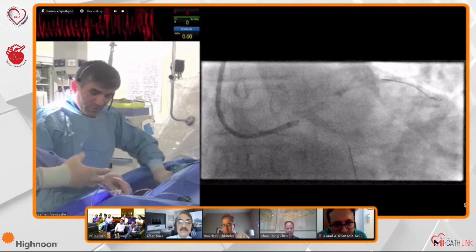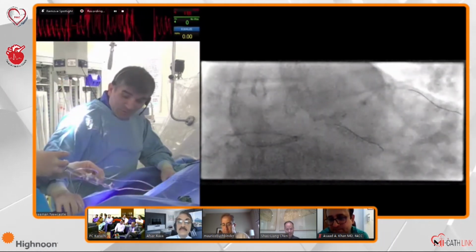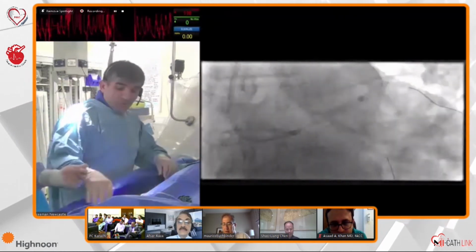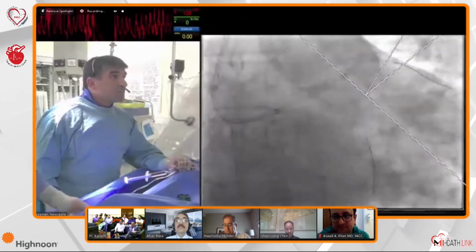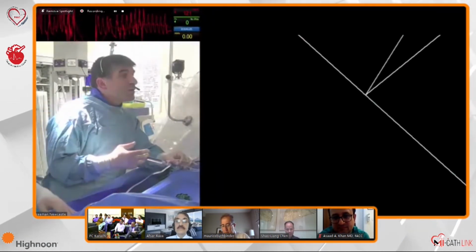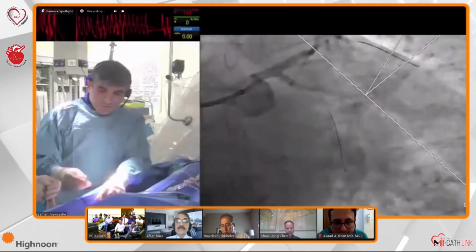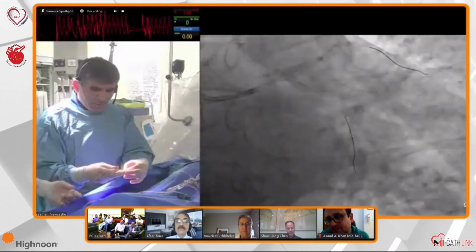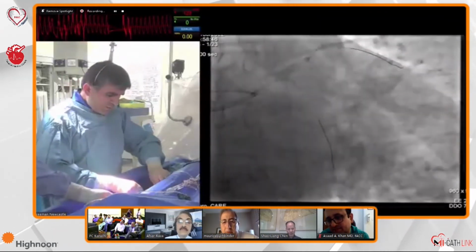Here we go. Take that away. The wire has been pulled back a bit, but that's okay. That's fine. Okay, let's have the IVUS, please. Open up for me, Louis. Open up a bit. Open up, unlock. Okay, so here's the final angiographic result, and we'll get the IVUS going for you. I'll get the guide in a little bit more at the end, but can you put the camera on the IVUS, please?